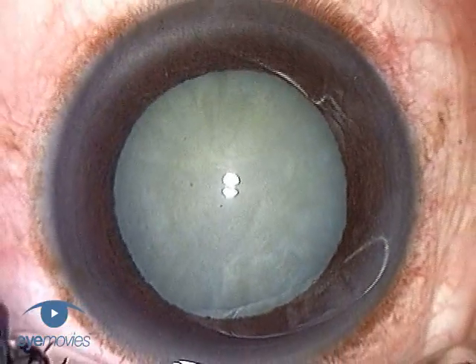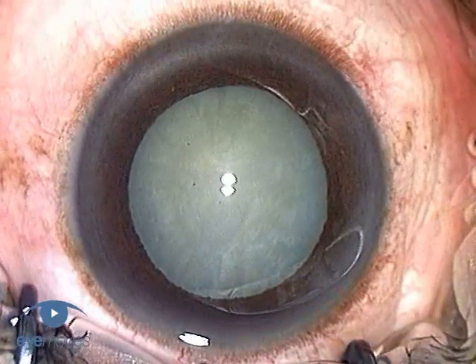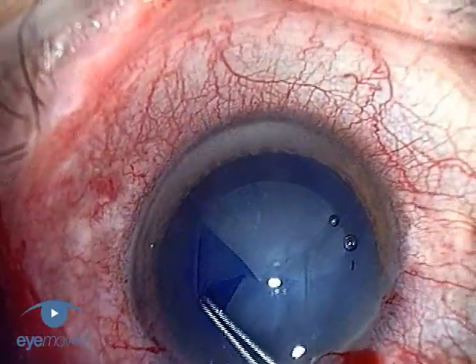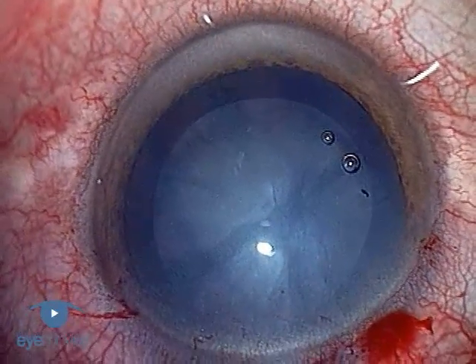Staining the anterior capsule has enormously facilitated performing capsulorhexis both safely and reliably when there's poor visibility. This is typically in cases with brunescent or white cataracts like this one. Trypan Blue and ICG have both been used for staining, but the majority of surgeons now prefer Trypan Blue where it's available, not only because of its lower cost, but also because of its more intense capsular staining properties.